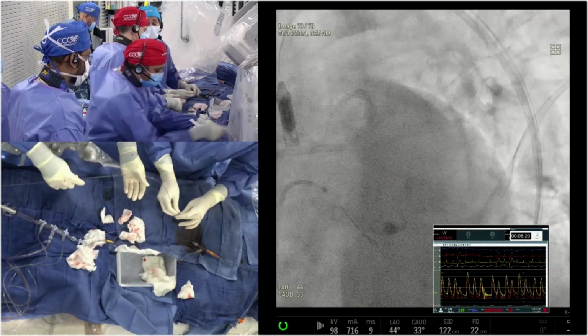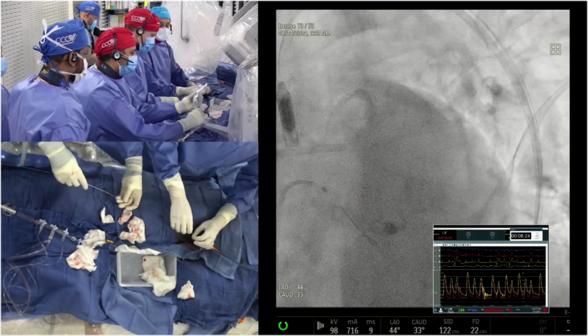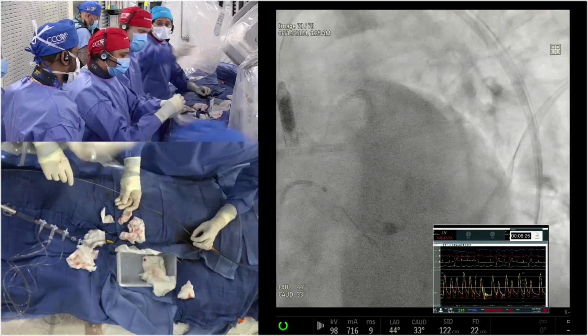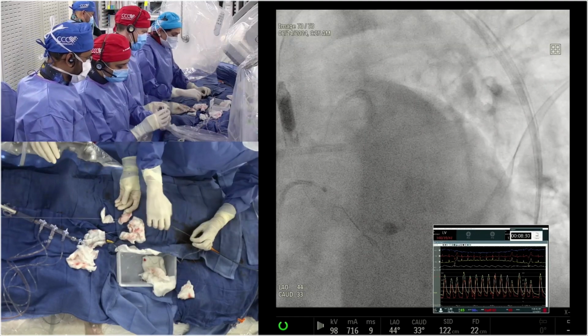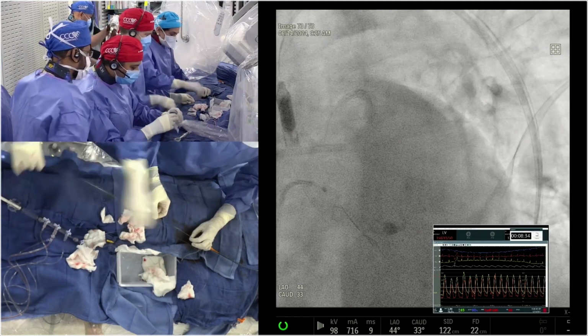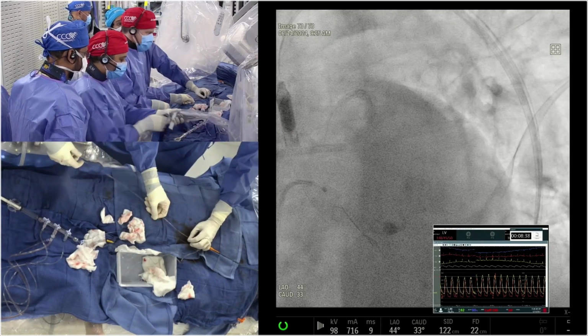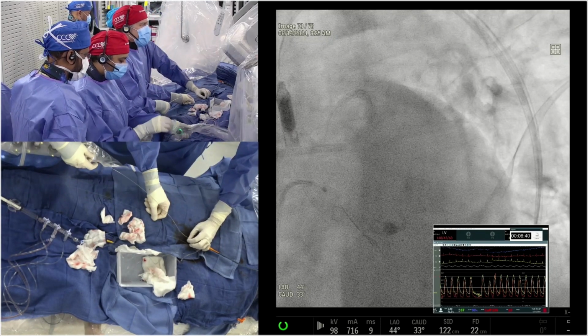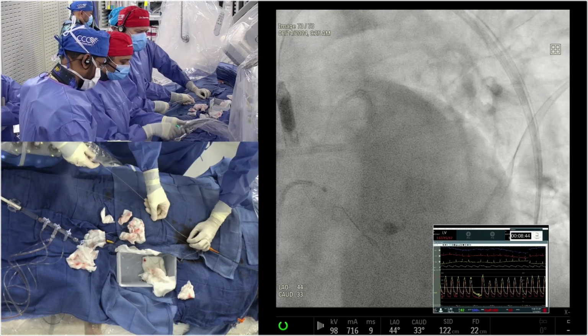Okay, go back to the nodule of the circumflex. Show us the IVUS nodule image again. So what I'm saying, if it is just the nodule, and then you decide on the diameter of the circumference of the nodule, you see that it's less than 90. And it's not a lot of calcium. Can you display it for us? We don't see it on ours. We're not seeing the IVUS.